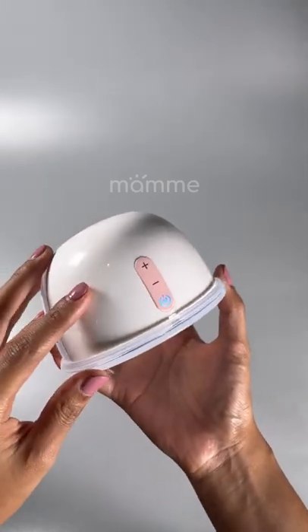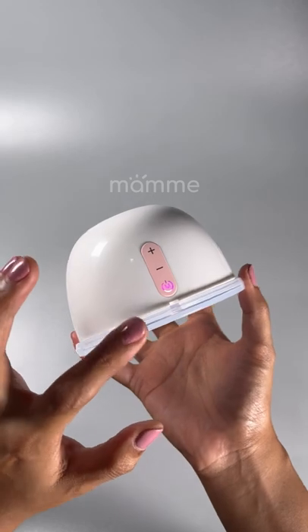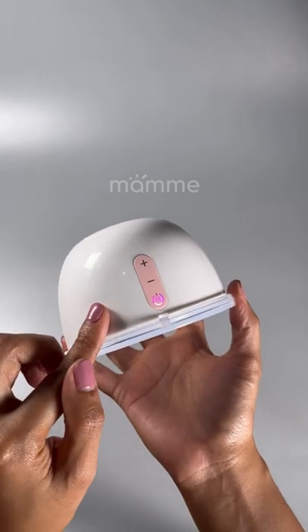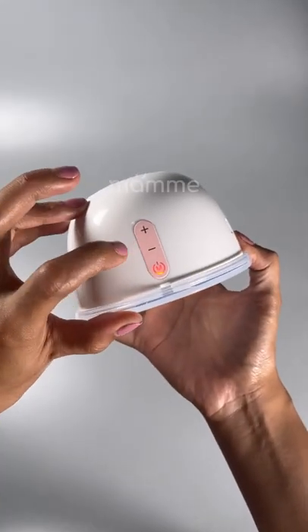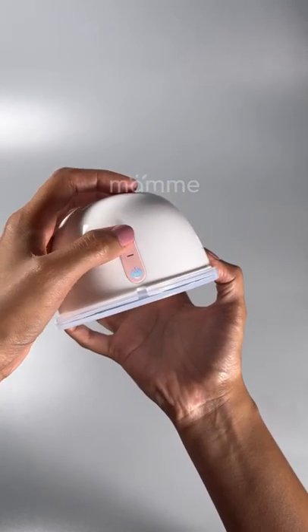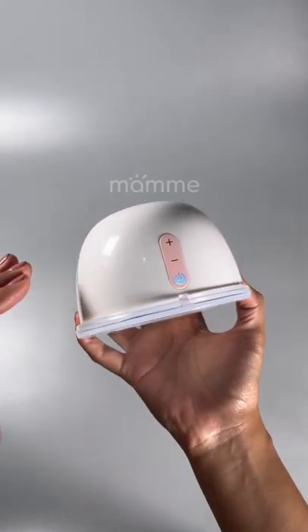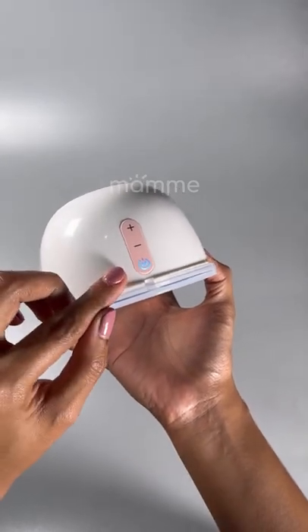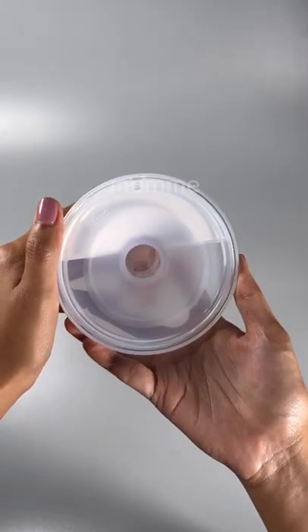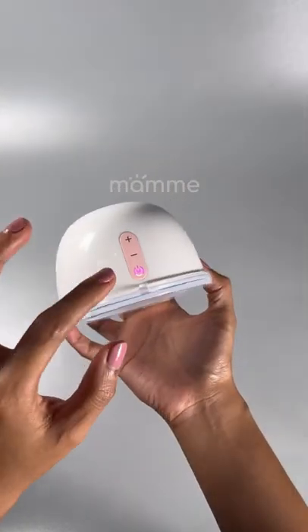And then there is the last mode, which is the mixed mode. This is a bit tricky because the mixed mode is a combination of the level ng massage mode mo and the level ng expression mode mo. Gawin natin na level 1 sa massage mode and level 9 sa express mode para makita natin yung difference. So, na-record natin ang massage mode mo, level 1, ang expression mode mo, level 9. So, when we go to mixed mode, yun yung lalabas. Diba? One small, one long. So, ganun ang mixed mode.